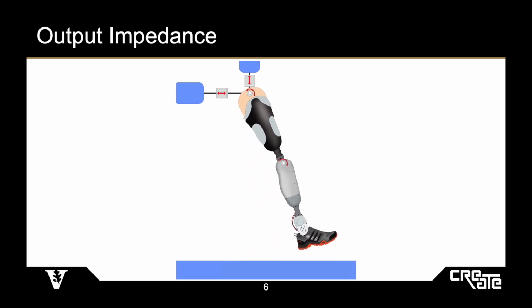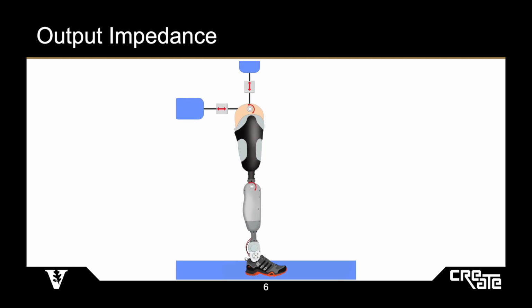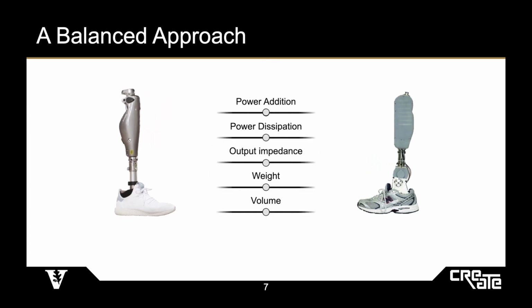Obviously, these devices can add power to the system to make up for this. However, making them respond as smoothly as an inertial system is a difficult control problem. Additionally, the increased impedance can make it more difficult to sense nuances in the person's actions, which can make it feel to the user like they are left to adapt to what the knee is doing instead of the other way around. Traits such as active torque output and impedance are often thought of as Boolean values. However, the reality is that these traits exist on a spectrum.